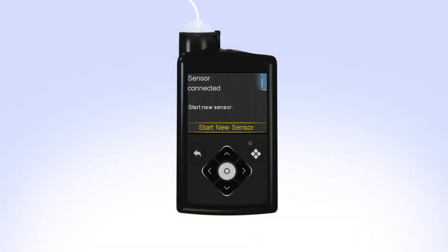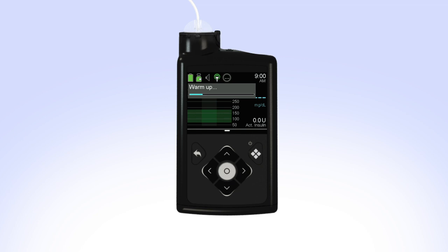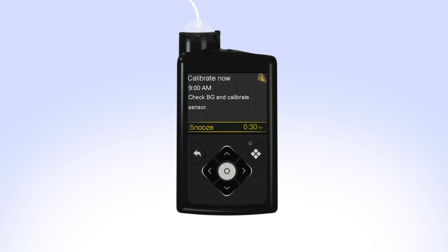When the sensor is ready to be started, your pump will show the Sensor Connected screen. Typically, this screen will display in less than a minute, but in some cases may take up to 10 minutes. Once the screen appears, select Start New Sensor. The pump will display the Sensor Warmup Started message. Press the down arrow, then select OK to clear the screen. Your pump will go back to the home screen and will show Warmup until the sensor is ready for the first calibration. Your pump will notify you with the Calibrate Now alert when it is ready for its first calibration.